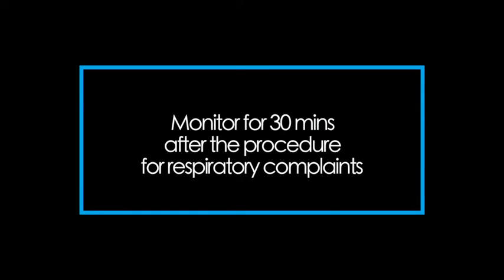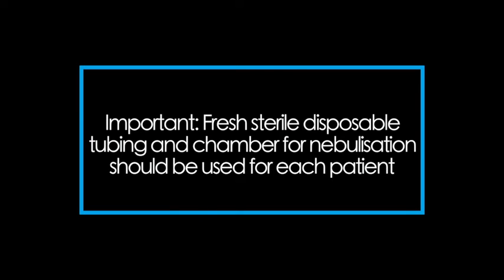Monitor for 30 minutes after the procedure for respiratory complaints like respiratory rate, pulse rate, chest retractions, wheeze, etc. Fresh sterile disposable tubing and chamber for nebulization should be used for each patient.